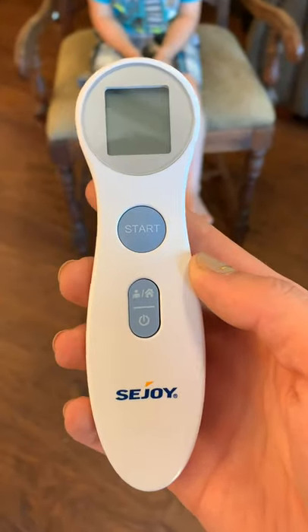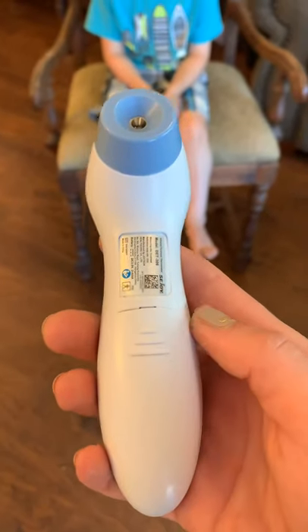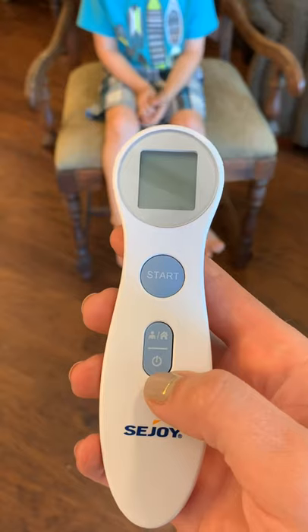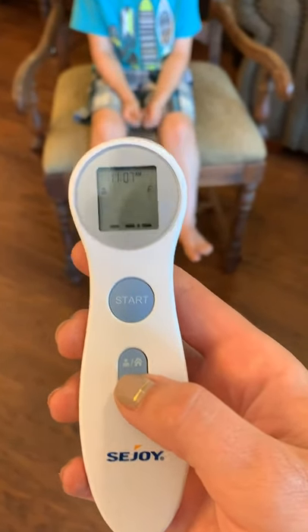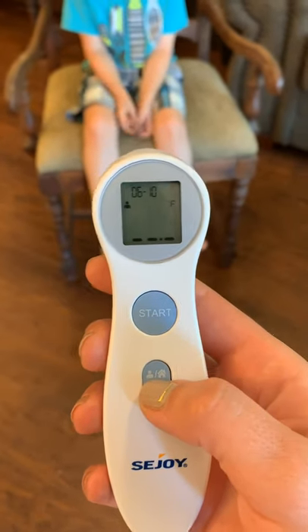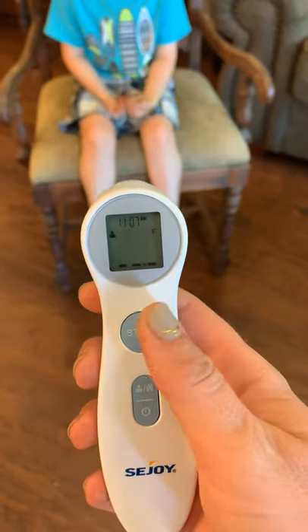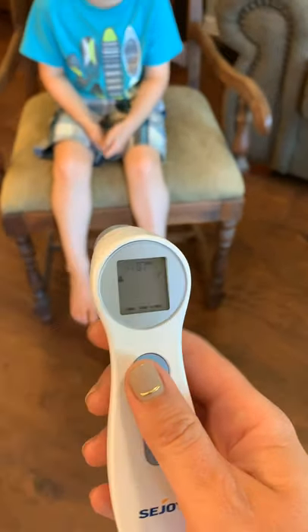To set up your no-touch thermometer, add the batteries and follow the manufacturer's instructions. Turn on your thermometer by pressing the power button and wait for the thermometer to calibrate. When you see the ready screen, hold the thermometer two to three centimeters from the forehead and press the start button. Hold the thermometer in place until you hear a beep.